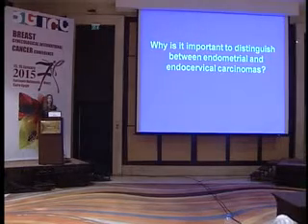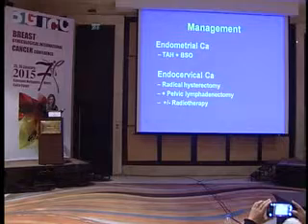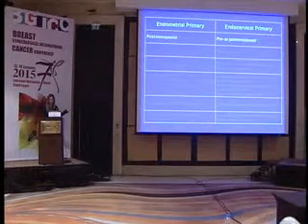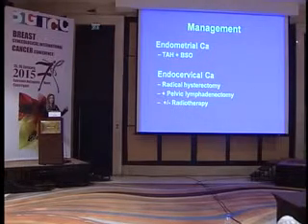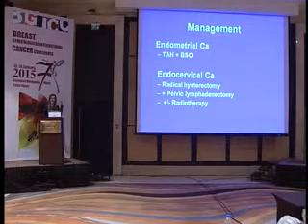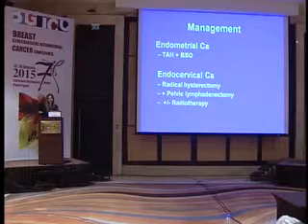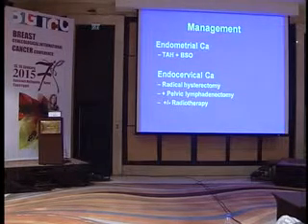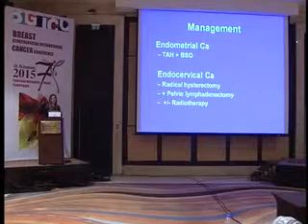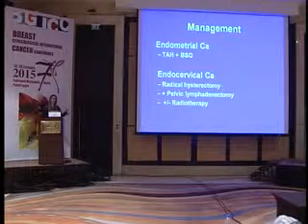Endometrioid adenocarcinoma. If you have ECC and you get a lesion, I'll show you an example, but it's very important to differentiate. I have a malignant lesion in the ECC, in the cervical glandular curettage. Is it endometrioid? Because I have a variant of AIS as endometrioid. Or it's endometrioid type, but is it from the cervix or from the endometrium? It's very important because the treatment is completely different.